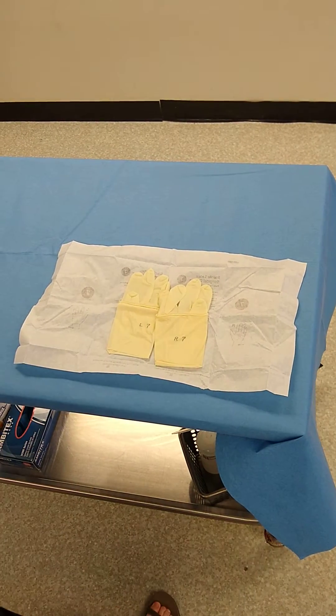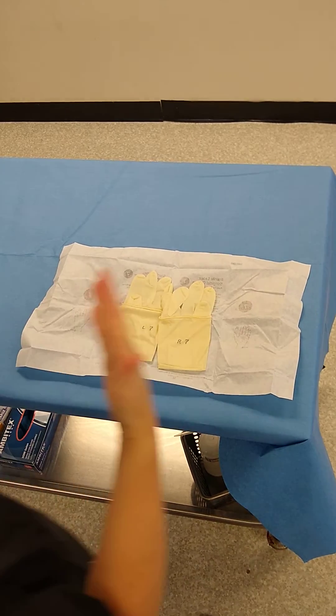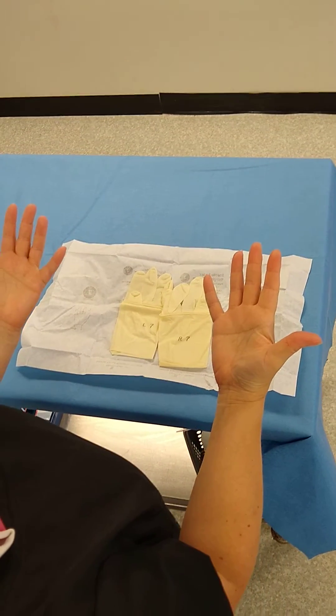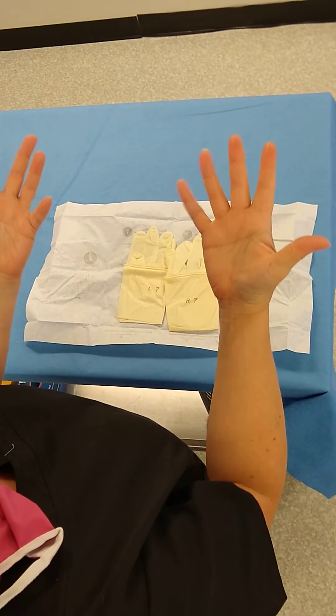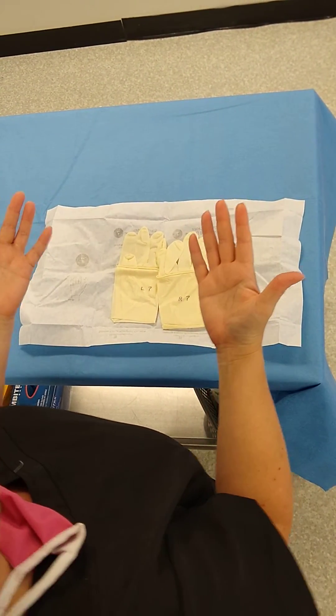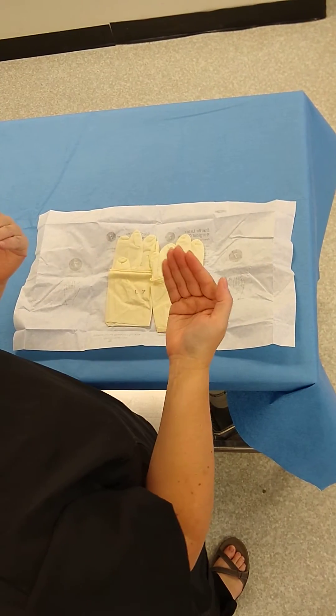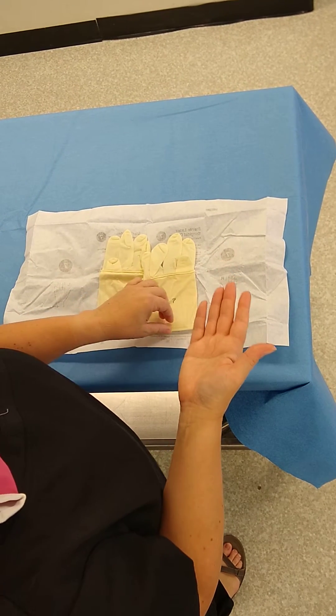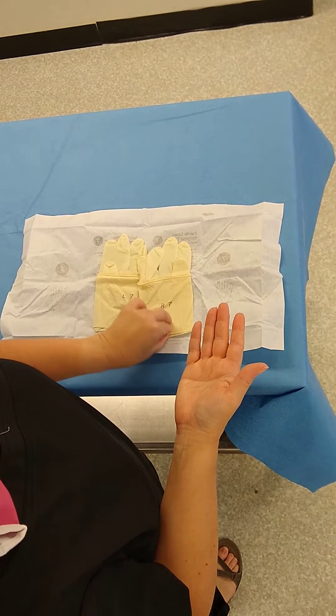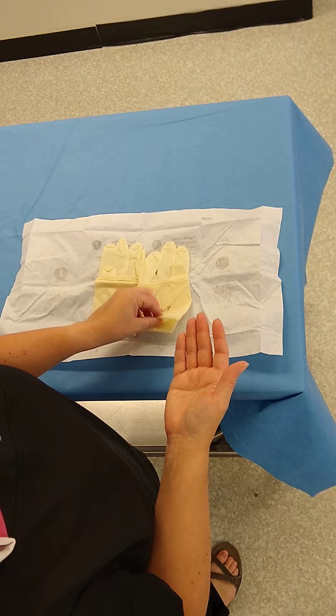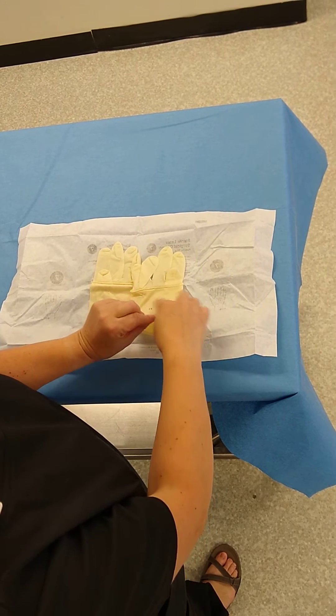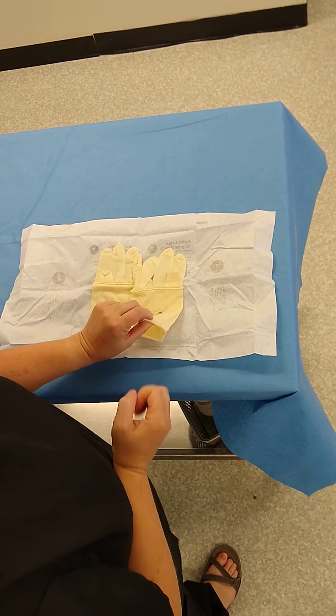I'm going to pretend that I scrubbed and I'm now here to put my gloves on. When you open glove your hands, you can never make them absolutely sterile. So you cannot touch the outside portion of your gloves. I'm going to grab the inside lining or edge of my gloves. This is the inside of your glove; that's the outside.